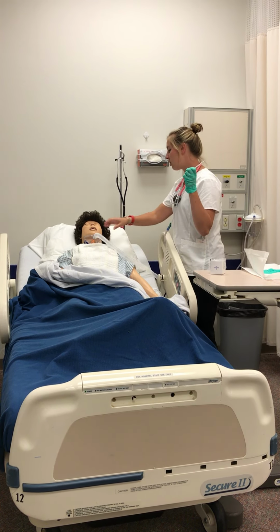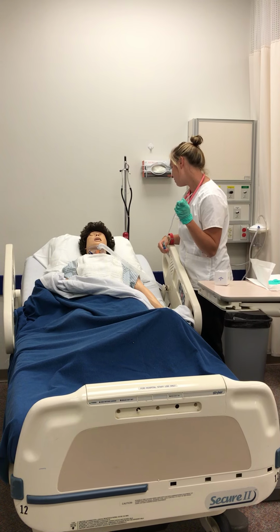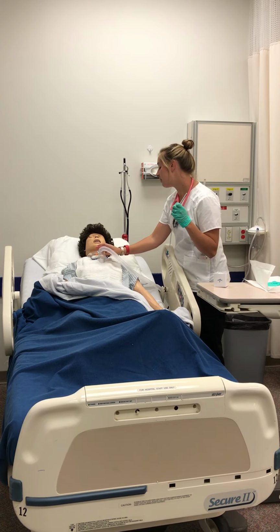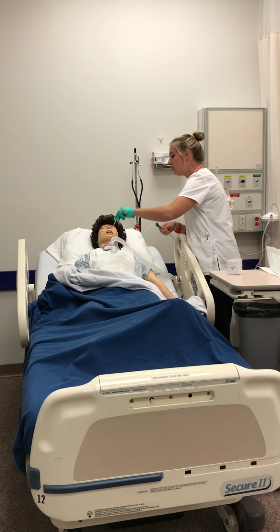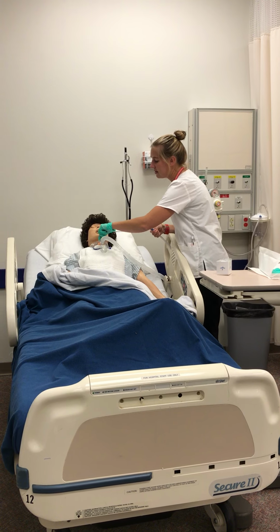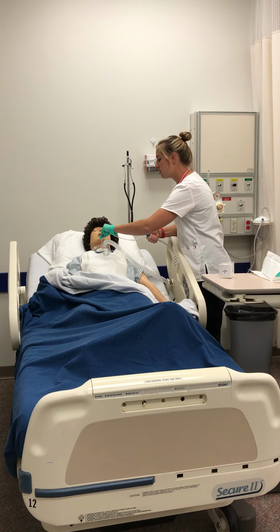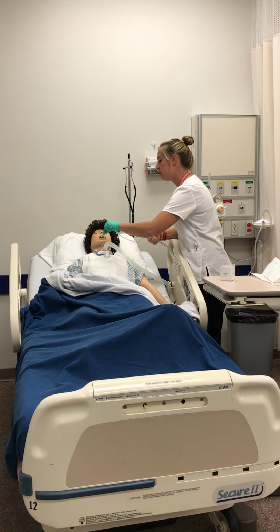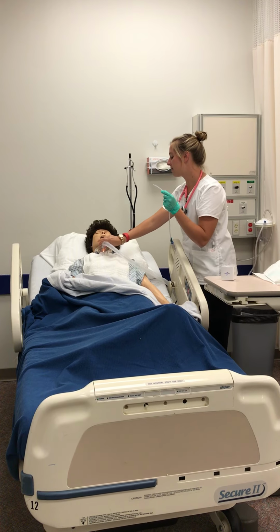All right, Gretchen, are you ready? I'm going to take your oxygen away, so if you would like to take a couple of deep breaths for me before we get started. Great, and just a reminder to keep coughing if you feel like you need to, all right? I'm going to place the catheter into the trach until I feel resistance, and then suctioning and twirling the catheter intermittently all the way out, and placing our oxygen mask back on.